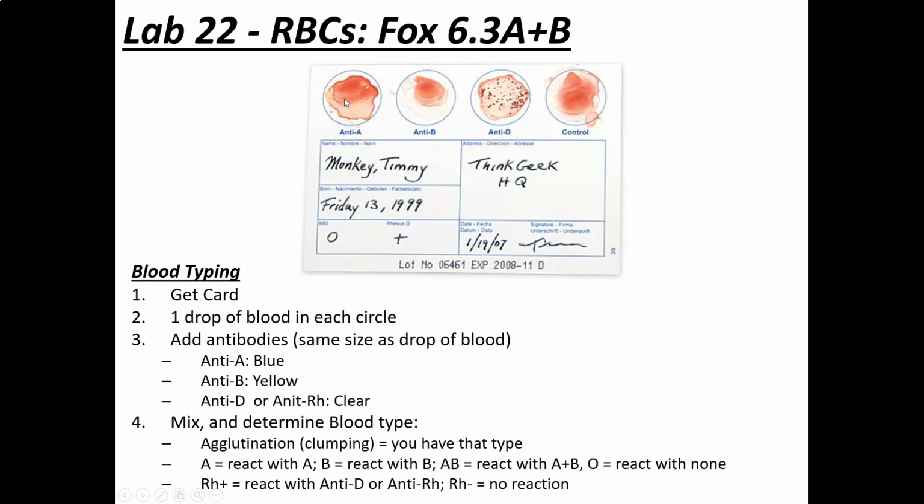Okay? In the ABO blood grouping, there are basically four possible results you can have, 99.99999% of the population. So here they had no reaction, so this would be a reaction where it agglutinated. So in A, there's no reaction. If you look at B, there's also no reaction. In B, it's the same thing, but now we're looking at the B protein. It's just another protein, whether it's present or absent on the surface of the red blood cell. So there's no reaction there. So this tells me that based on this result, this person does not have the A protein and they don't have the B protein.